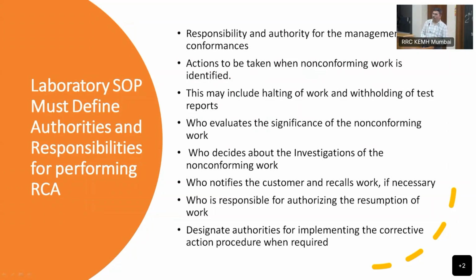So this can be picked only by the ground staff, right? I cannot come and investigate and come up with a lavish reason of outlier. Like random error. Random error, I tell you, is very commonly used word.